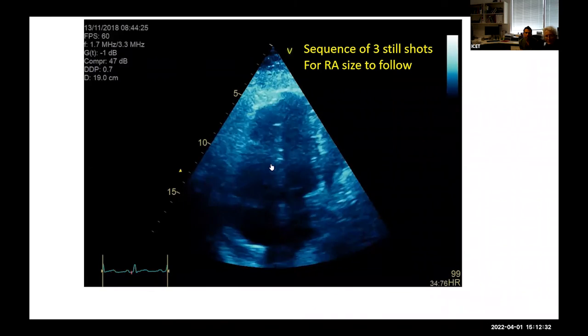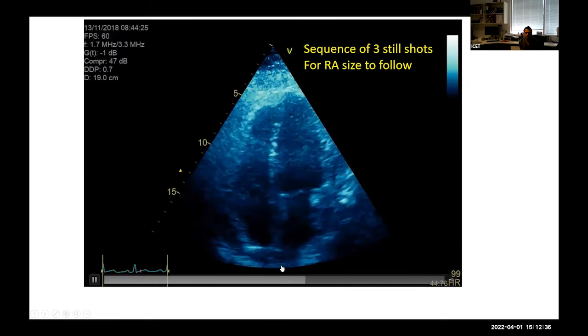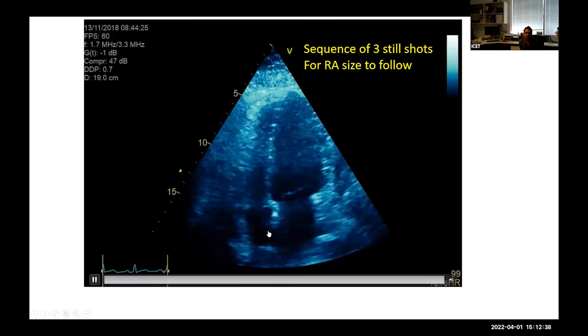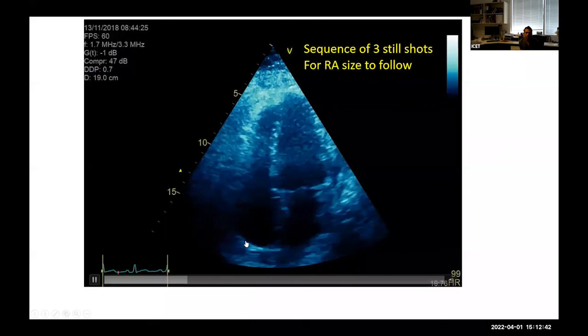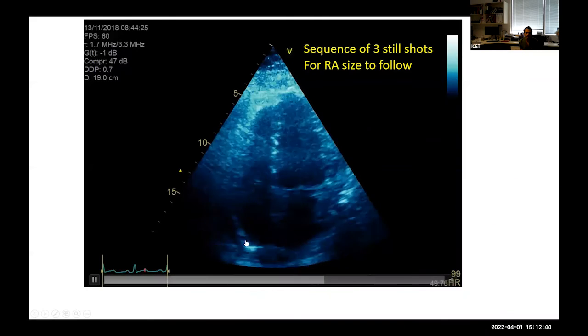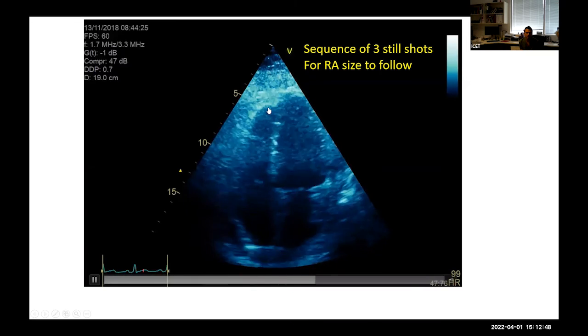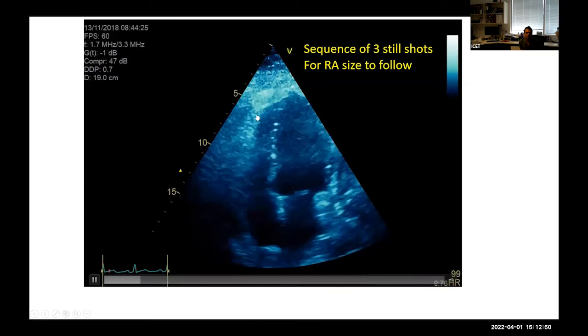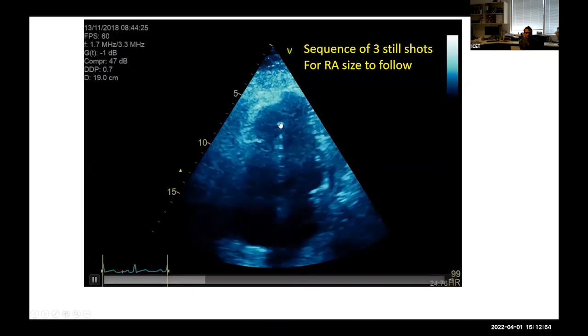And this bounce you're talking about, the interventricular. The LV doesn't look like it's thickening all that well. You just can't see the apex. Yeah. The base is alright, but the midsections are probably not. So I think there's RA collapse, there's some RV collapse as well.